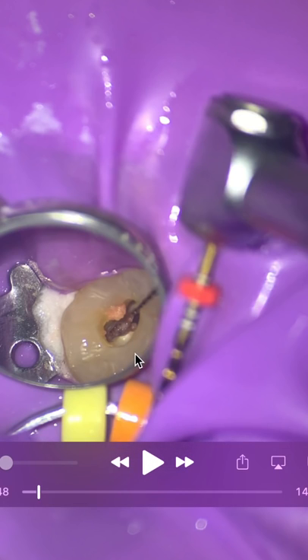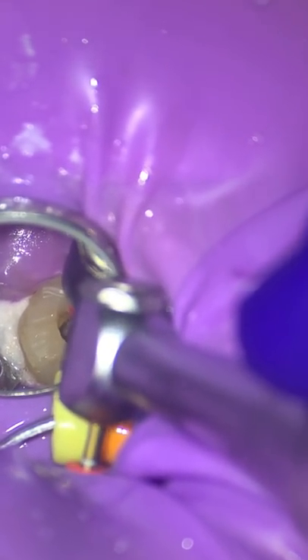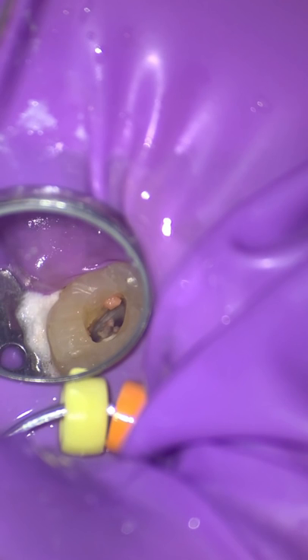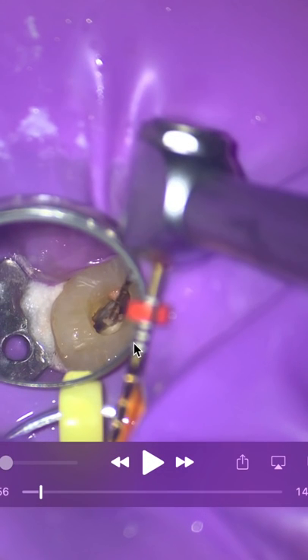Once you get into these teeth, what I'd recommend is getting the palatal pulp tissue out as fast as possible if you can. My experience has been that if you're brand new, it's going to take some time to do these root canals, and the palatal canal is where the patient starts to feel it after a while. So get all that pulp tissue out as quick as possible when you start your root canal, and that way you don't have to worry about the pulpal tissue. The periapical tissue, I can't help you with if you're taking your time.